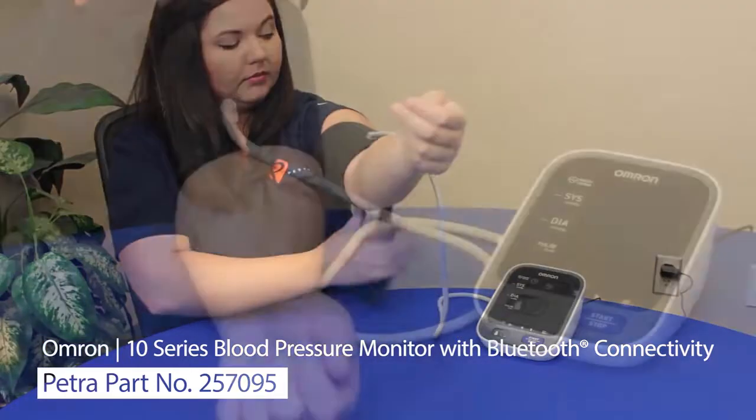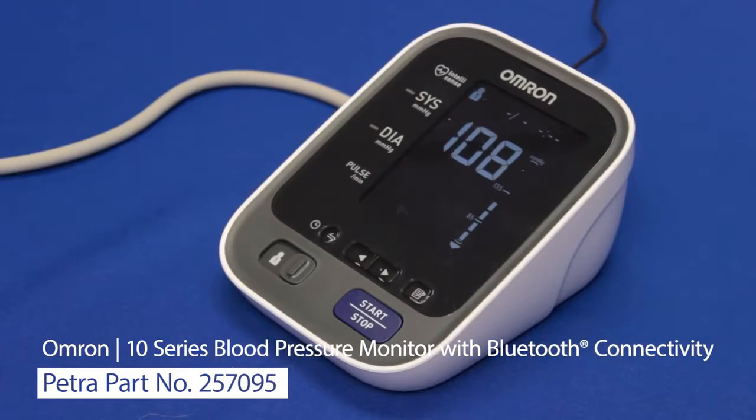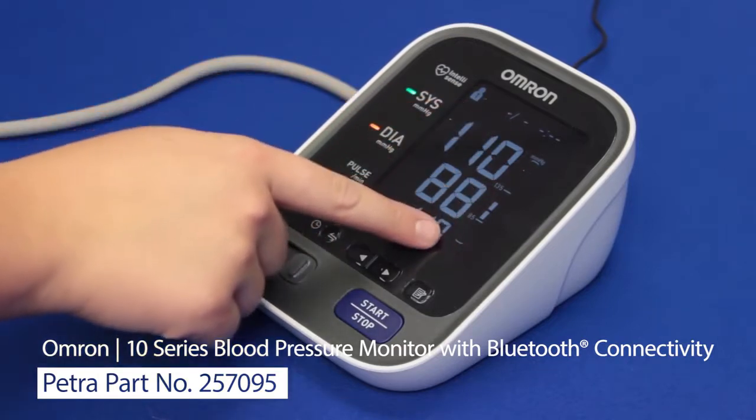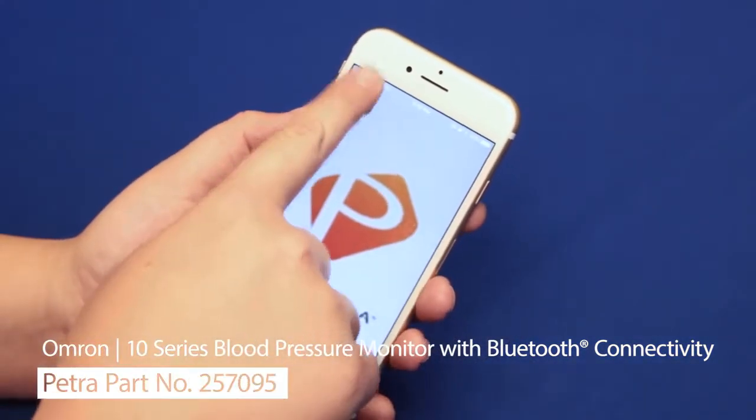Now we're going to show how easy it is to use. One button starts the process. Its TruRead technology will take three consecutive readings one minute apart and then calculate the average for better accuracy. Notice how bright and easy to read the numbers are. The BP level bar shows the normal range for easy comparison.